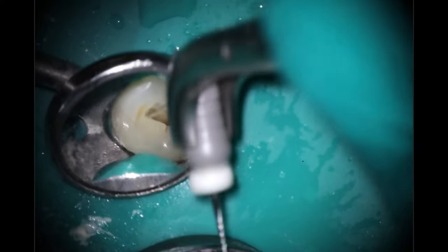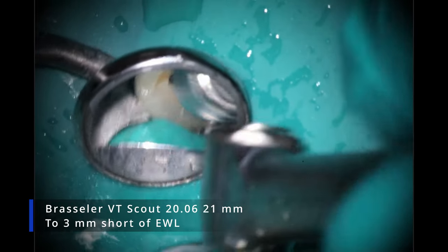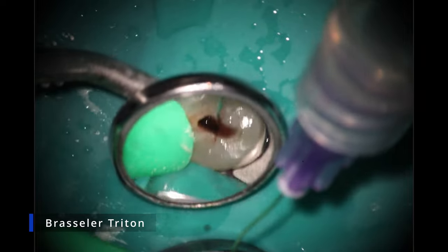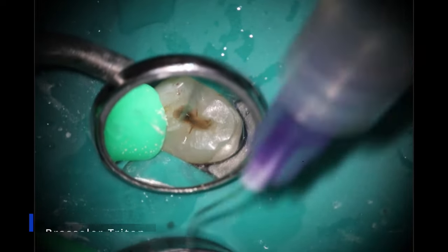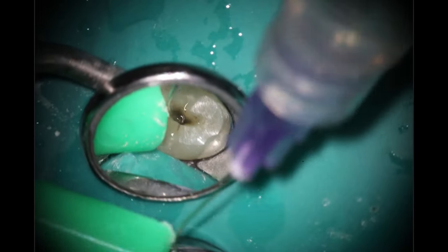I like to start off with an 8C file, taking it to about the working length I got from the cone beam. It's really important to go through the cone beam beforehand and get all the information you can from it. Then I take a 2006 — this is the Brassler VT Scout. I switched to these about a year ago and have absolutely loved them — they work extremely well. This just gets out any coronal impediments that might be in the way when I need to go get my length. I've now switched to using the Brassler Triton instead of traditional bleach and EDTA. It is more expensive, but it does seem to do a better job of getting things nice and clean and dry, and I felt more comfortable being able to one-step cases.